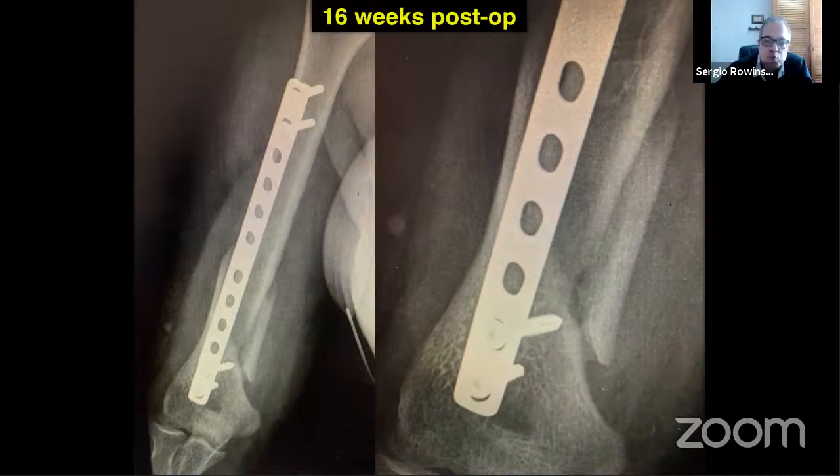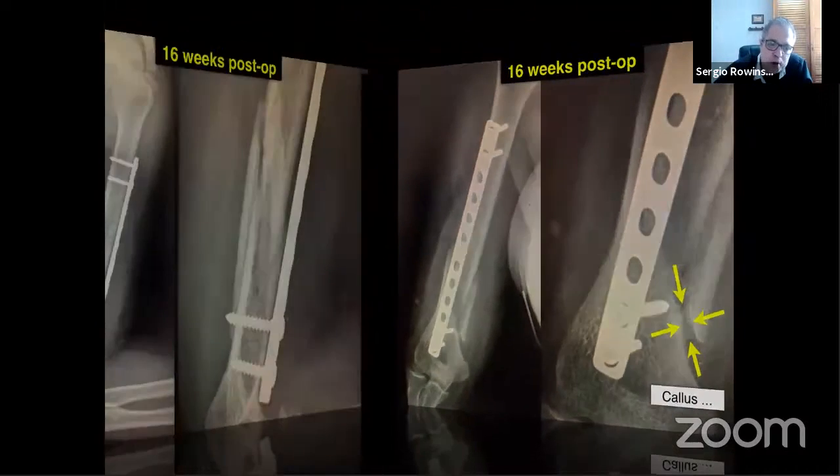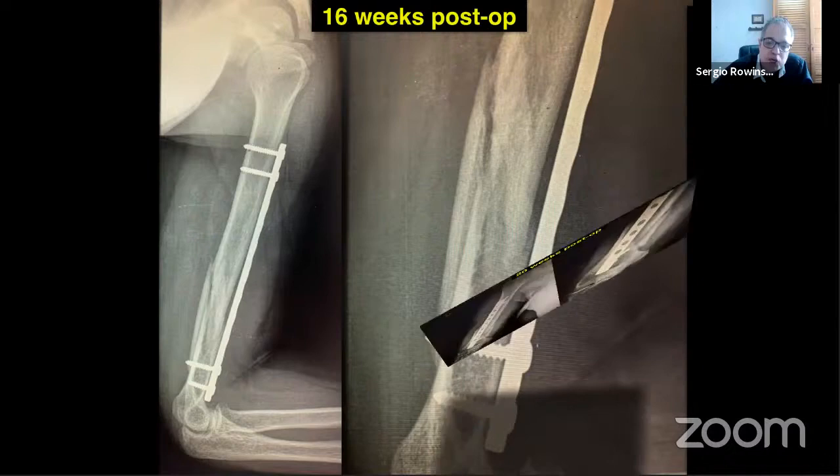So when you come to around 16 weeks, now you have callus, you see on the AP on the right side. And Jupiter, Rockwood, Campbell, they say remodeling takes months, years. So it's just a matter of waiting till you see all of these healed, but it's difficult for me to keep these patients after 4 months under follow-up because they are so good from a clinical point of view that they don't understand why I am following them. I'm just following them because of radiographical documentation. This is the left view with some callus, but it's just a matter of waiting.